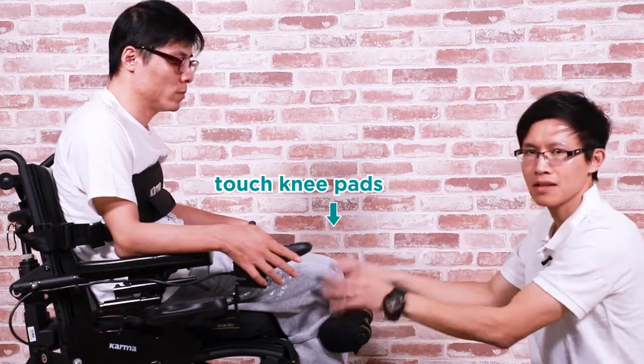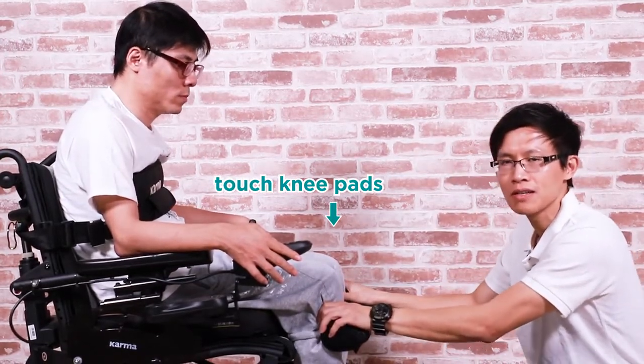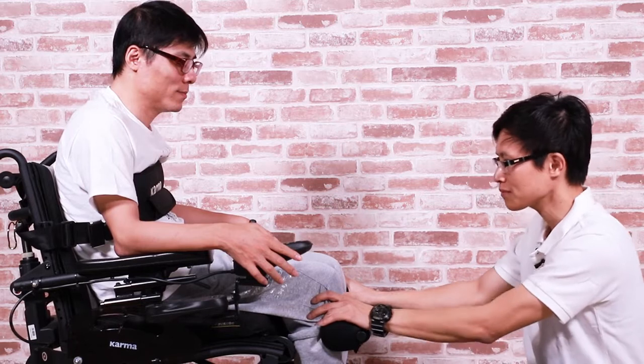Secondly, when the user is standing up, we strongly suggest that a caregiver or a therapist should be standing in front of the user and use both hands to touch the knee pads, making sure the pressure is not too concentrated on the knee. Meanwhile, observe the user's facial reaction. Make sure that he is not getting dizzy or turning pale. Talking with them is usually a better way to facilitate this process.